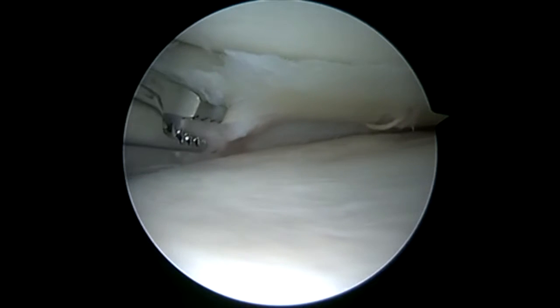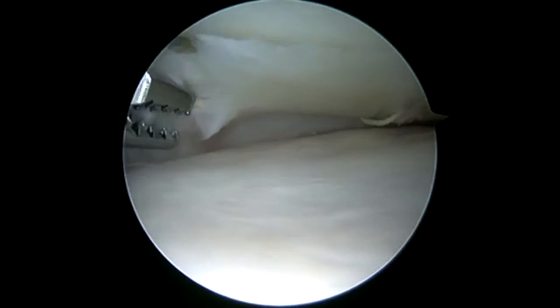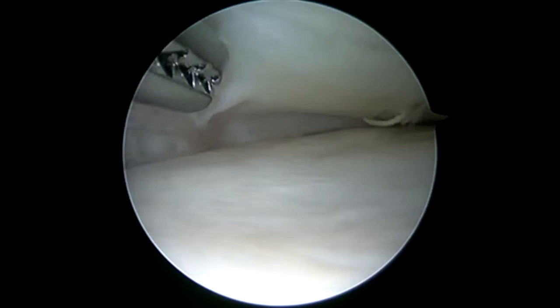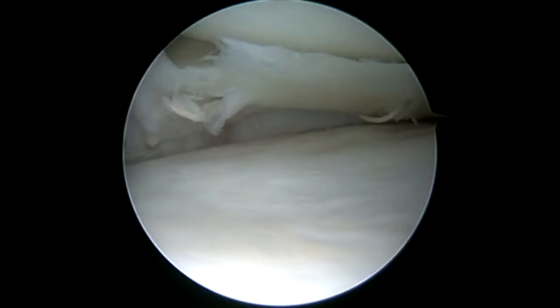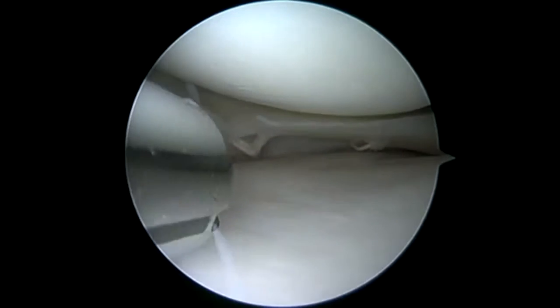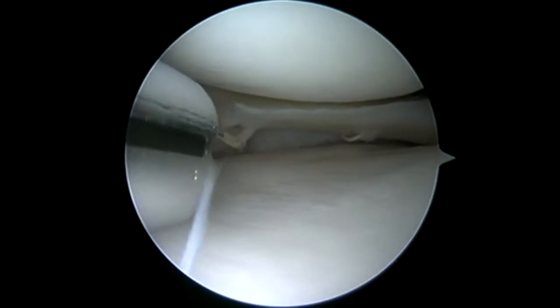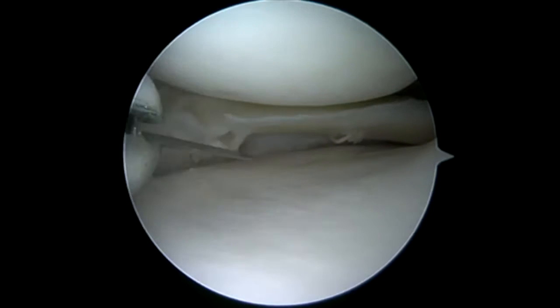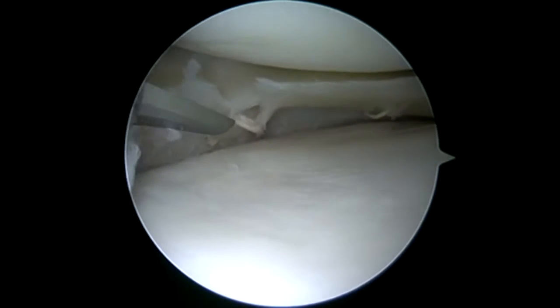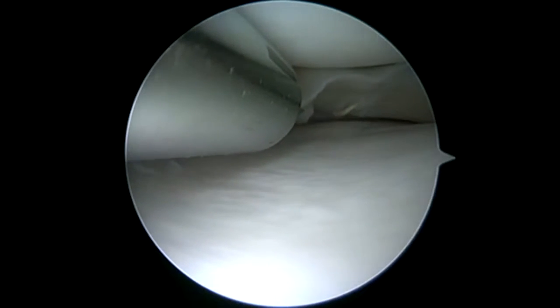Now, if we just yank on these, we're going to destroy the meniscus trying to remove it. So instead, I'm going to bring in a knife blade. You can use a standard number 11 blade — I actually have a fair amount in hip arthroscopy, so I'll use a hip blade that Arthrex makes so I can extrude the blade, keeping it protected until I get up to the sutures. I'll go ahead and cut the sutures on this medial implant, and you can see a secondary implant in that posterior horn. I'm going to have to open up that meniscus to get to that implant because it's placed within the meniscus itself.